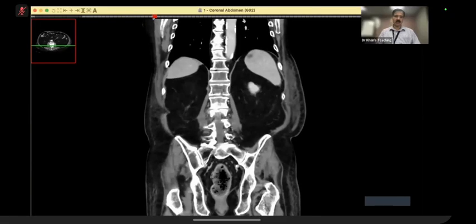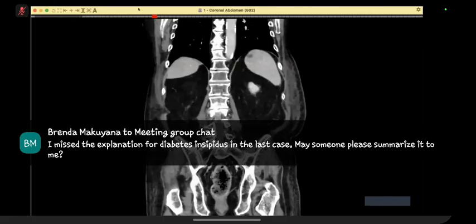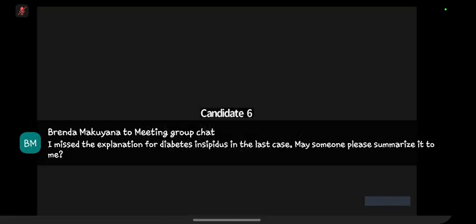Okay, madam. Now give me the conclusion. So I'm thinking this is a case of complicated diverticulitis with abscess and metastasis. Right. Thank you.